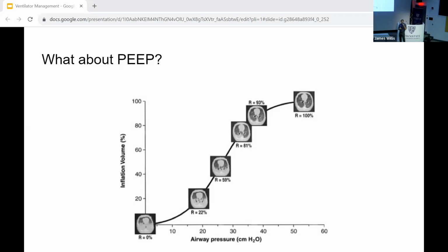Alveolar units that are completely collapsed may be recruitable, versus the alveoli, let's say at the top, which are participating in gas exchange, which are at risk for harm by overdistension, versus the lung segments in between that you're trying to balance: atelectatic trauma and overdistension. So you have to find where your patient is, and not every ARDS patient is going to be the same, right?